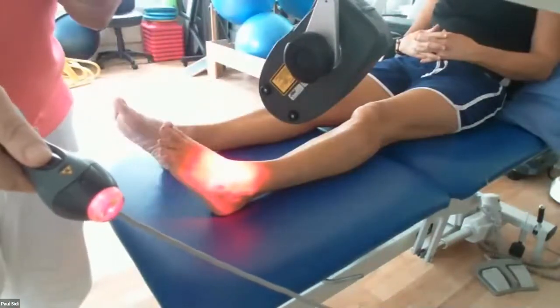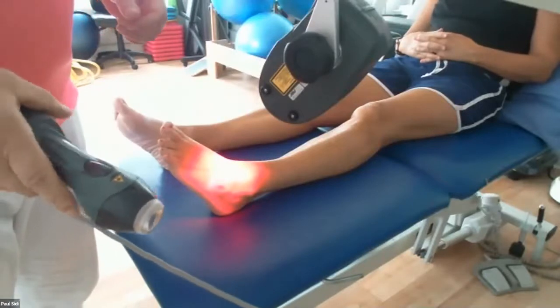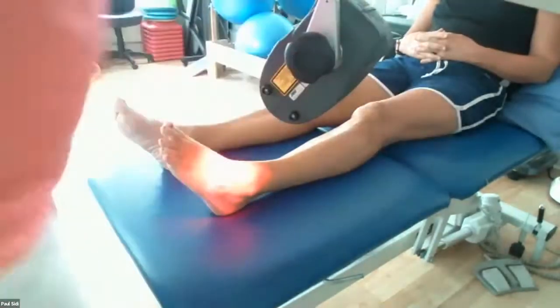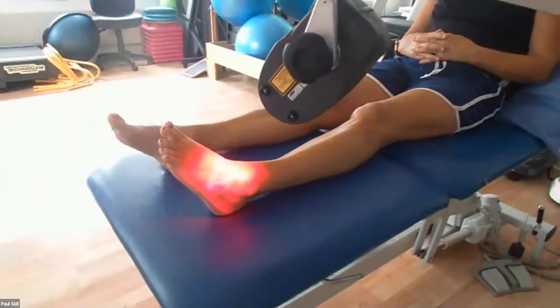Completely different settings now, different pathology. I think what I will do is, I don't think I'll treat her neck. I think I'll go and have my cup of tea. Okay? Whatever. Anyway, so that's the situation there. I'm going to let that continue.